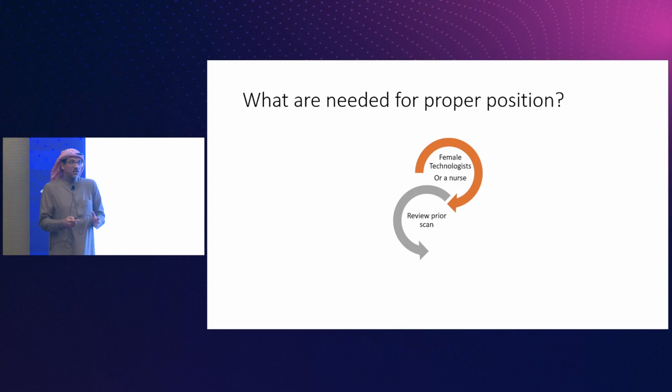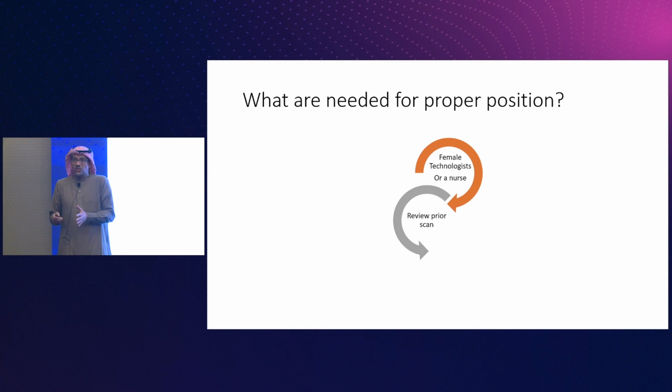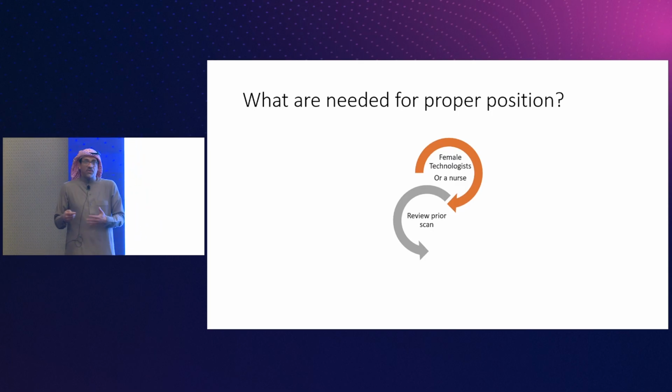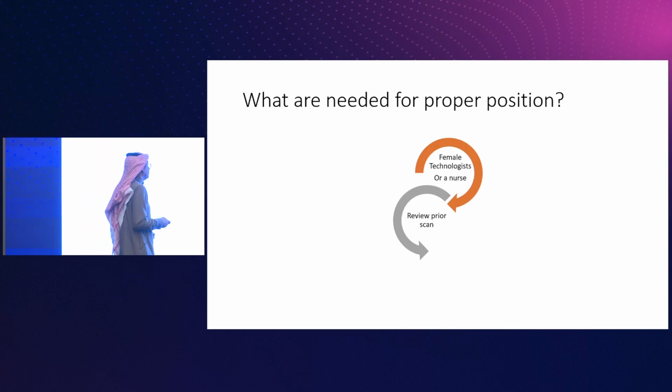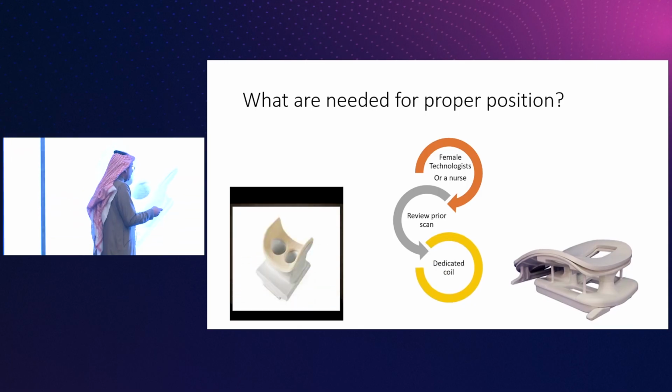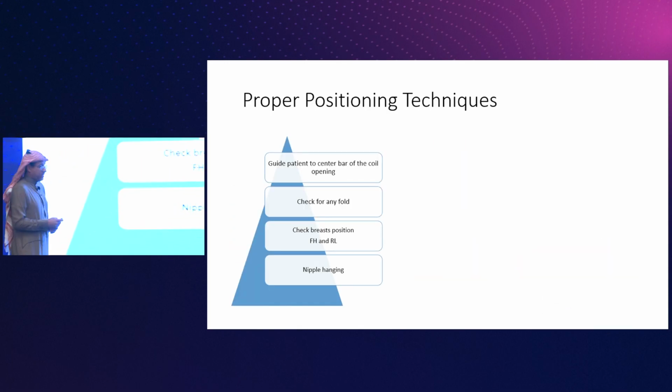When you have a nurse, do not just ask her to position. No, go with her step by step. Show her the proper positioning. Especially the Filipino and Indian nurses grabbed it fast.